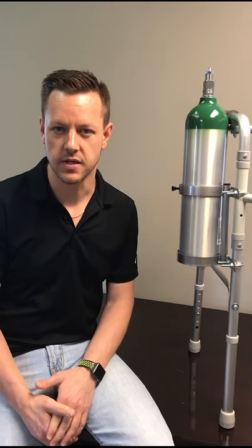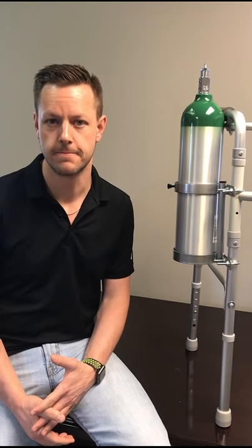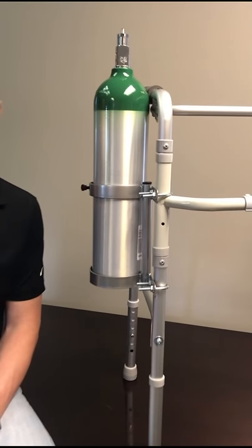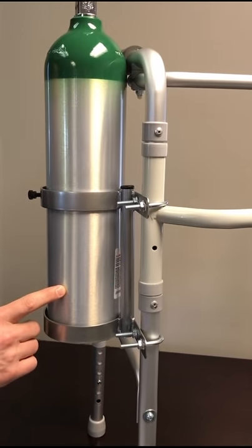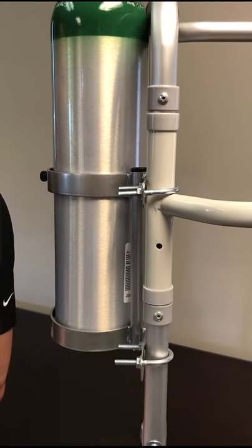Hi, my name is Keith with FWF Medical Products, and today I'd like to talk to you a little bit about our 1115W Walker Rack. This model holds one D/E-style oxygen cylinder and attaches to walkers with tube diameters from 3/4 inch to 1 and 1/8 inch.